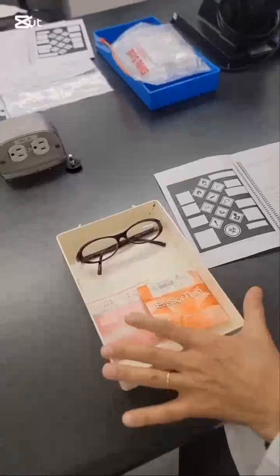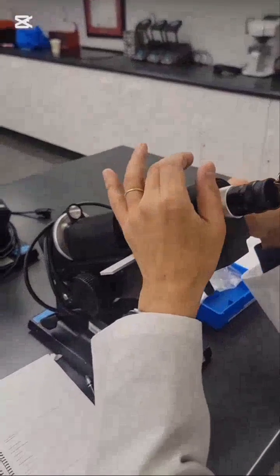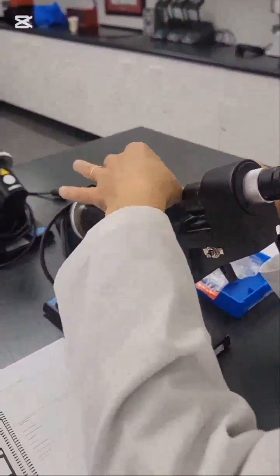In this video, we are going to learn how to use Essilor Kappa tracer, blocker, and edger. From the job order tray, check for the right lens. Put it in the lensometer, neutralize the lens, and spot the lens.